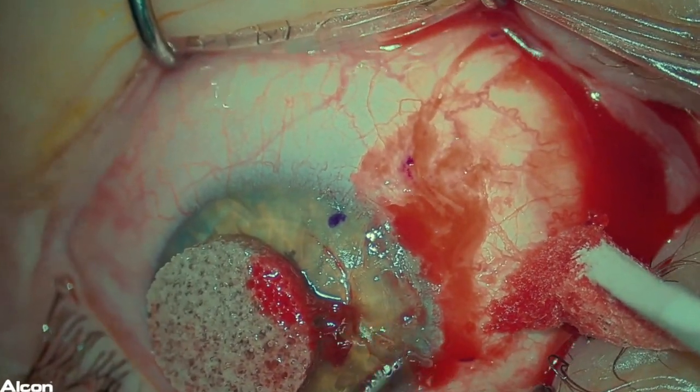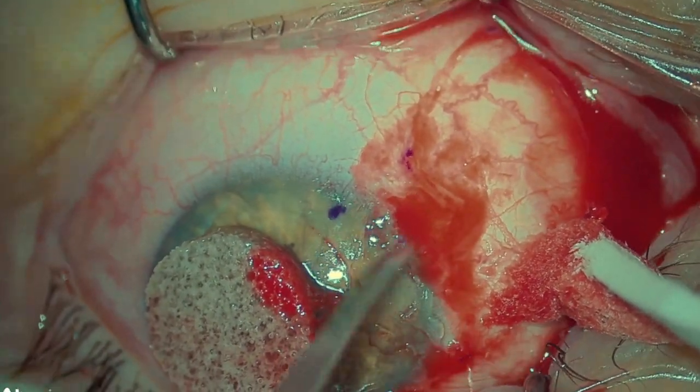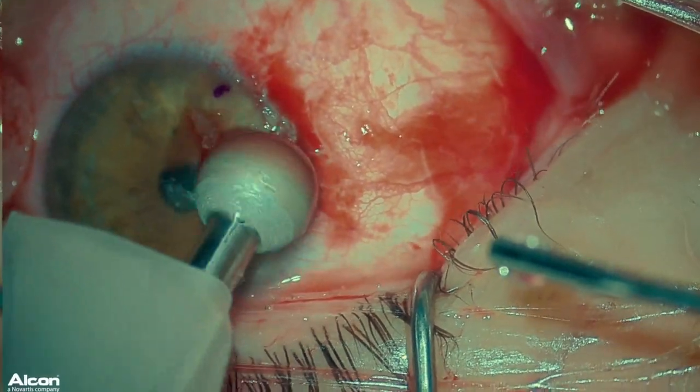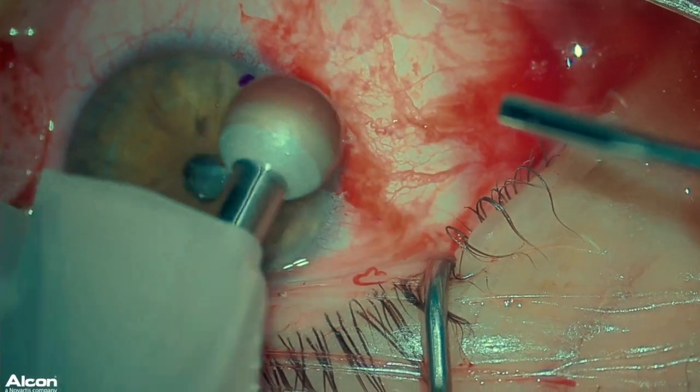There are usually some tissue remnants on the cornea and limbal area. The cornea can be gently scraped with a crescent blade to ensure removal of all surface cells. Polishing and smoothing of the surface can also be achieved with a diamond burr. A smooth surface will help aid in re-epithelialization and healing.